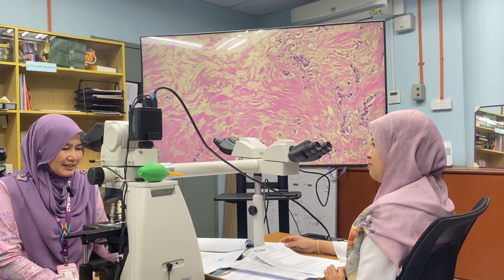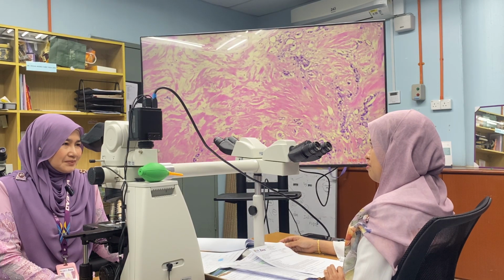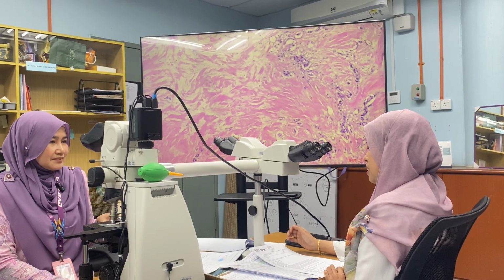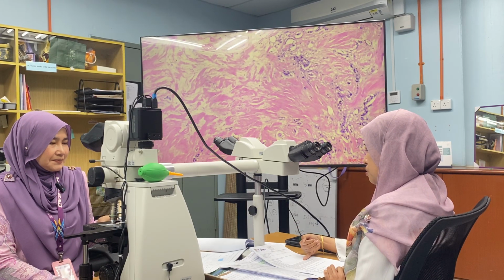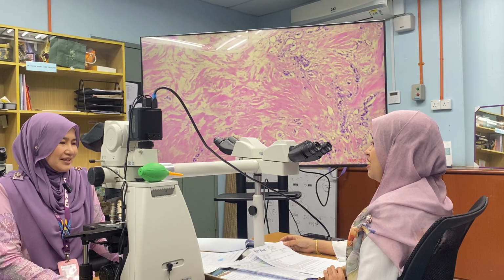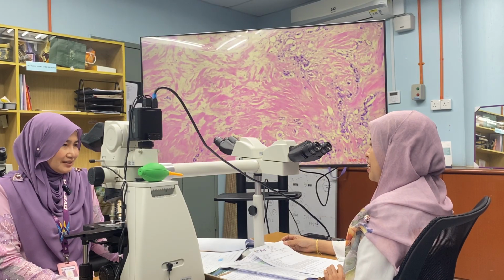Okay. And then the thing that I think we better do for immunomarkers, since this patient is ER/PR positive. So in molecular subtyping, what type does it become? Luminal A or B? Because ER/PR positive and HER2 negative, so it's luminal A. Sorry, this is luminal A. Okay. To confirm, is it really luminal A or is it luminal B? Yeah, we better proceed with that.